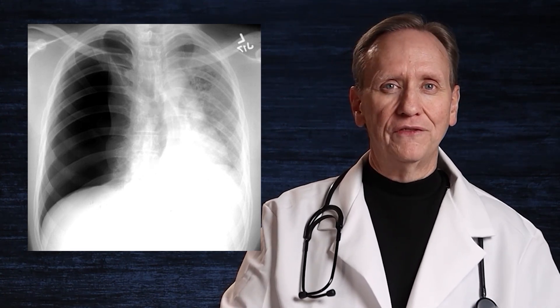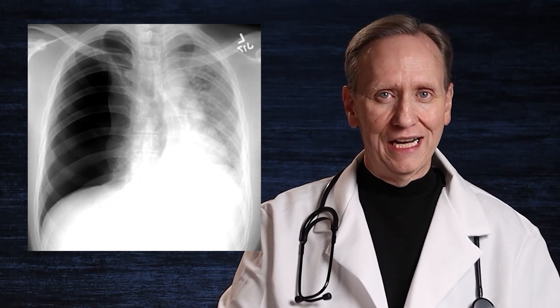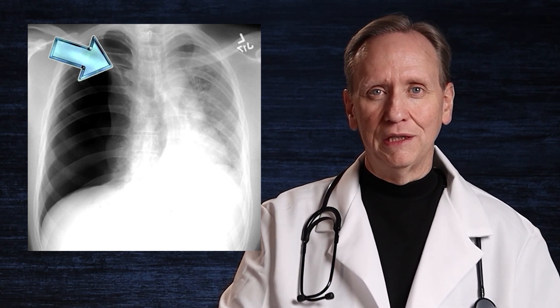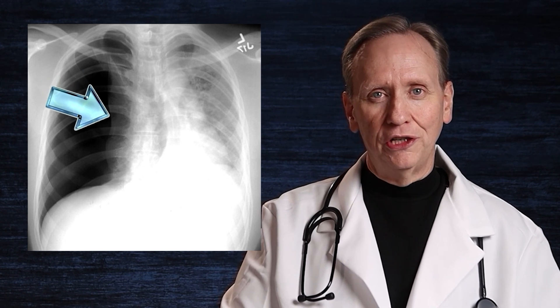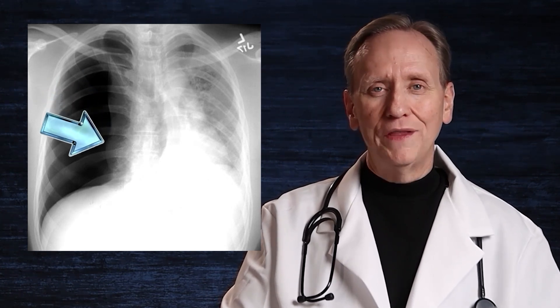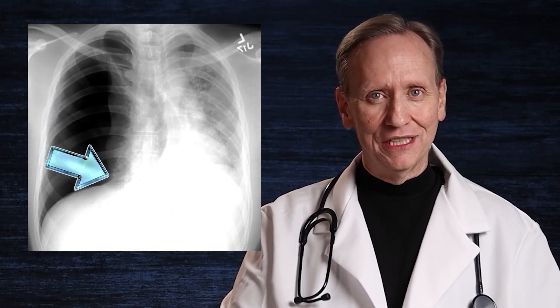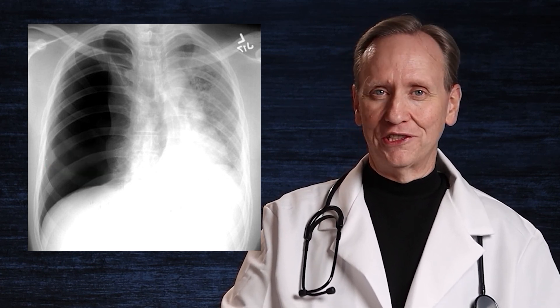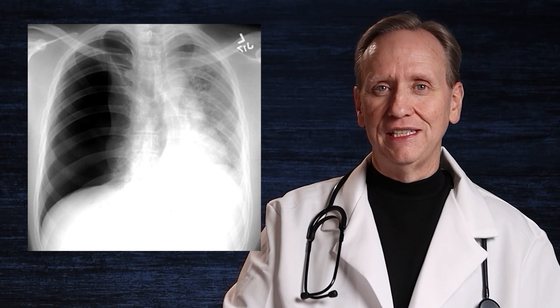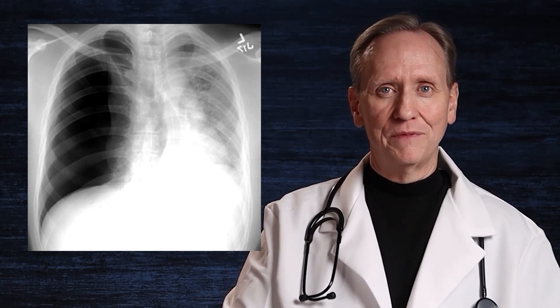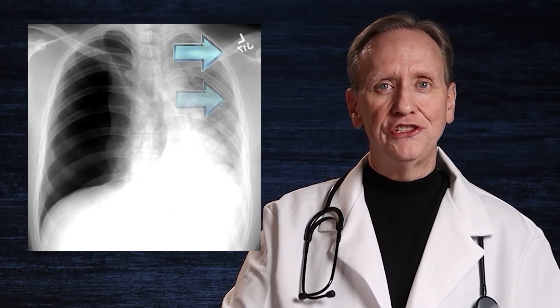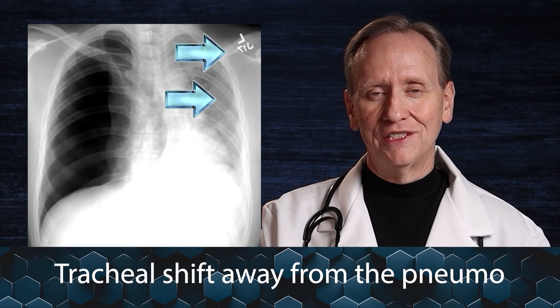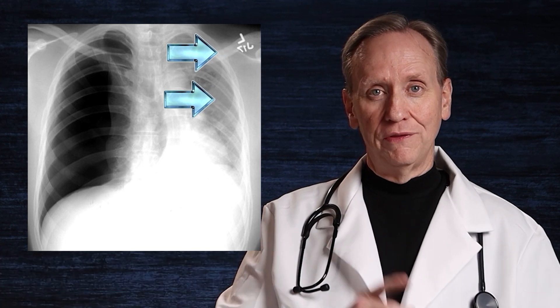There is another point of evidence: if you look very closely on the pneumothorax side — the collapsed, black side — you'll see very faintly in the middle a curvy line. These can be called curvy or curly B-lines, and that border represents the edge of the lung tissue. Notice the lung tissue does not collapse all the way into oblivion; it's still there. You can also see a shift of the trachea away from the hyperlucent or pneumothorax side.